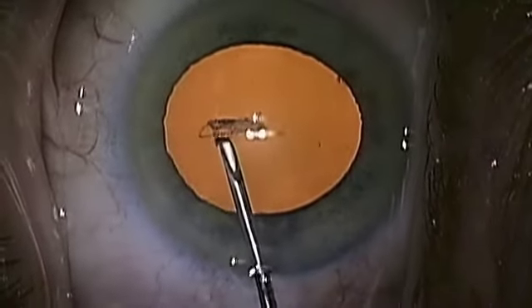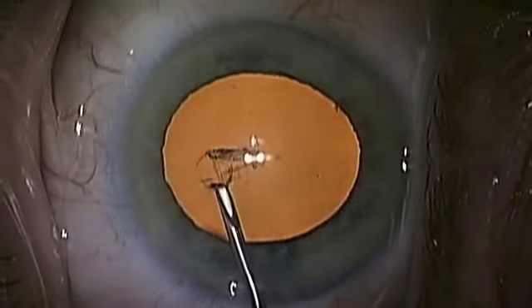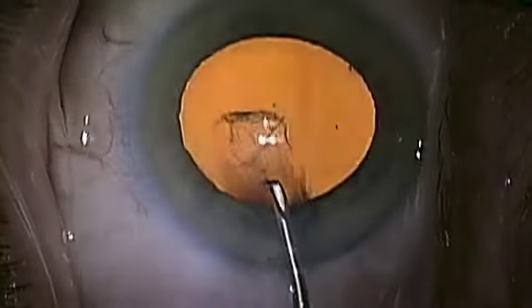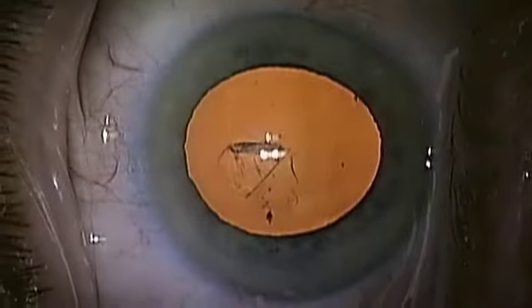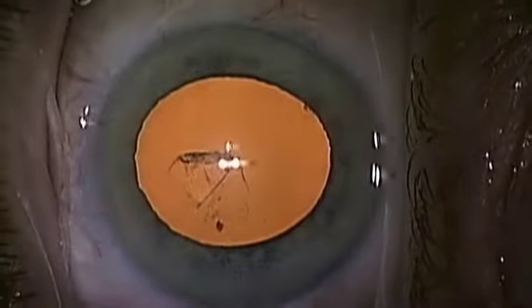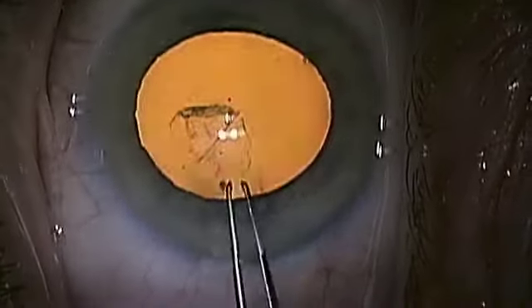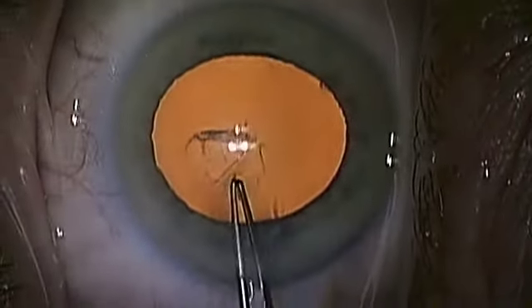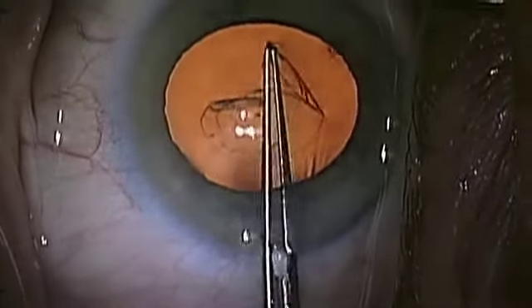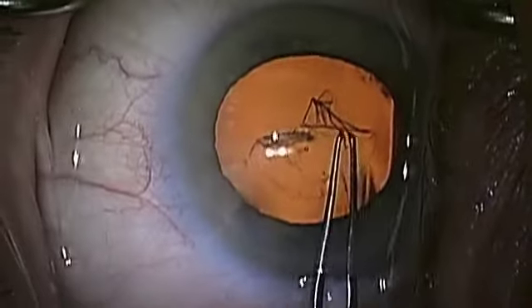Here is another example of a manual capsulotomy where the end result ends with a very nice circular opening in the anterior capsule. This is done manually. Optimally, the capsulotomy should be 5 millimeters and a perfect circle. You can imagine this is very difficult to do on a consistent basis manually, although I am fairly skilled with this procedure.